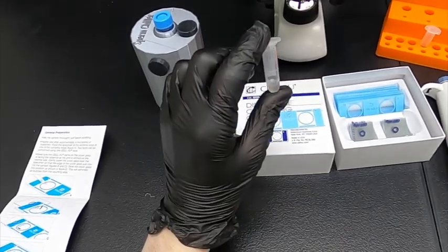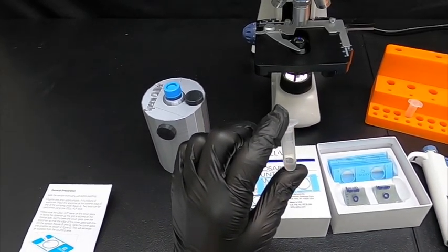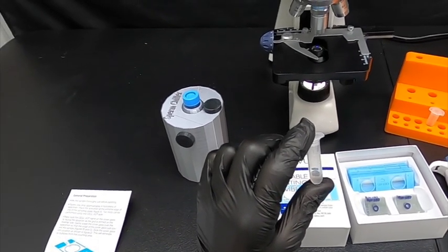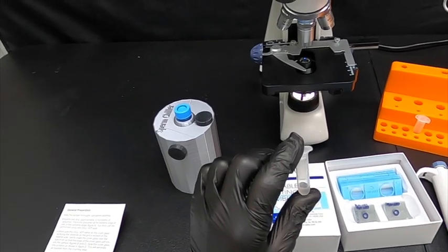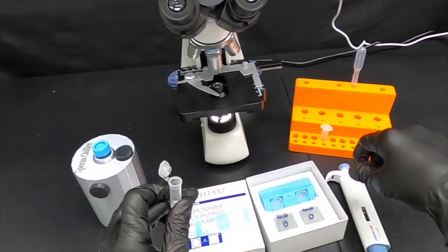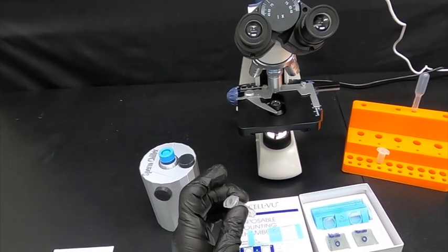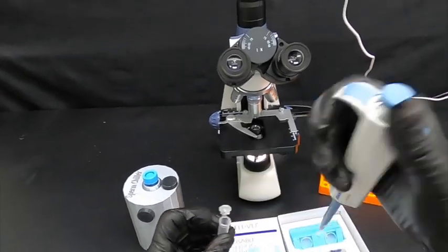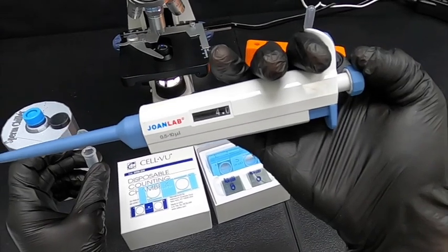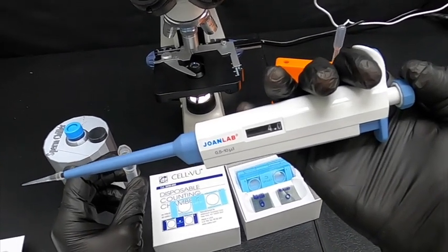We're back. We managed to kill off the semen in the sample to get an accurate concentration count. Again, we can't look at motility in percentage format with this test; it's just for concentration. As indicated in the instructions, we'll first mix it by gentle inversion or brief vortexing and set our mechanical pipette to four microliters. A little bit plus or minus is okay, but let's keep it as close to four as possible.